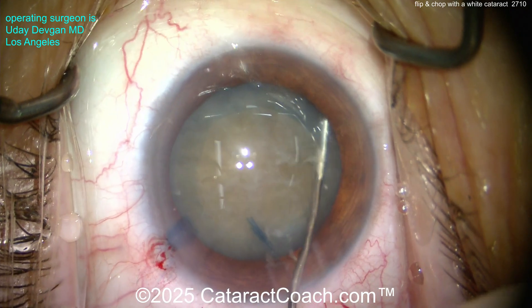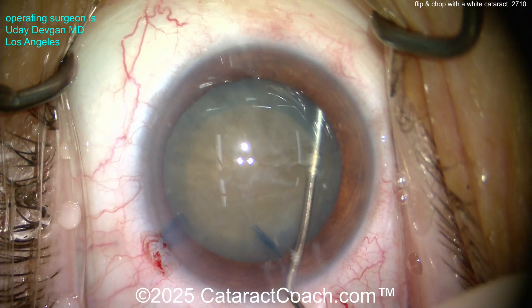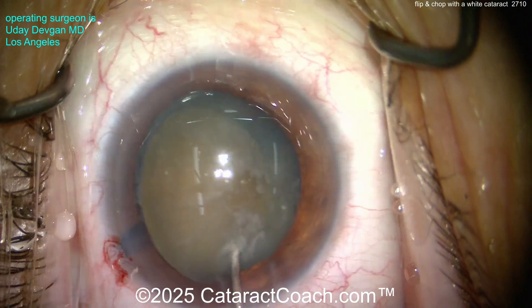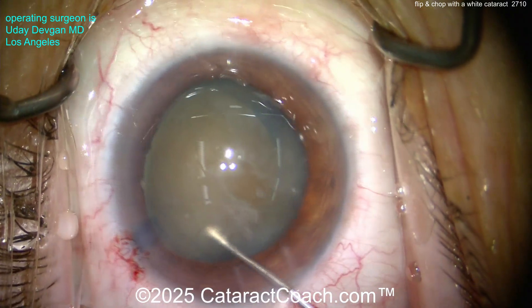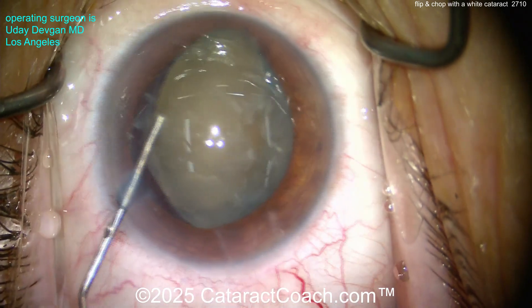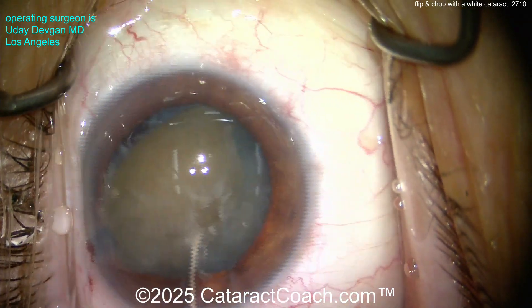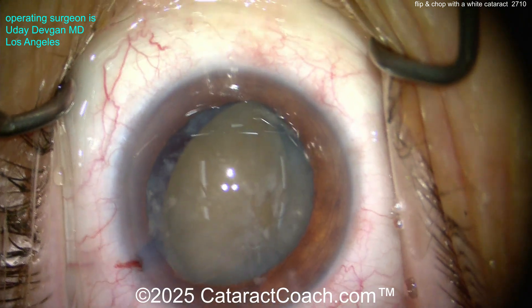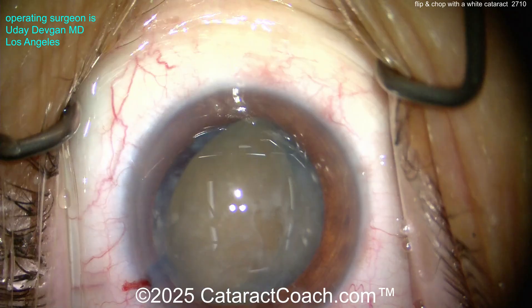You can see there's a beautiful five to five-and-a-half millimeter capsulorhexis. Slow and steady, gentle, gentle, gentle — there, the nucleus comes up. Use that cannula to help push that nucleus around. There it is — you see one pole came up. Go through the side port here and lift this nucleus a little bit more out of the bag.